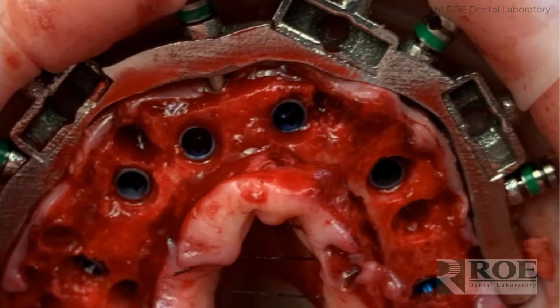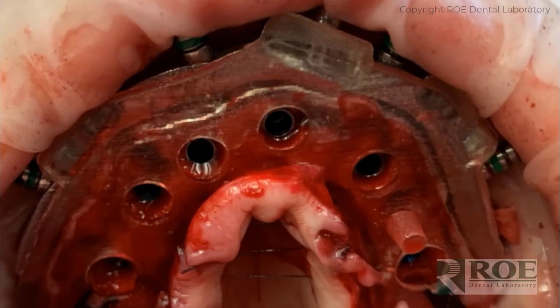All right, so here we are. All the implants are in. Then the carrier guide goes on. Now on the anterior, these are straights. 1, 2, 3, 4 straight implants. And on the posterior, you can see the black marks and the notches for the angled implants. The trajectory, this is kind of like an all-on-4 trajectory of these distal implants. The trajectory follows this notch, follows the black line here. And so the abutment screw, the abutment, the implant are all in line with this notch. That is how you know your abutment is in the right rotation after you've indexed the implant.